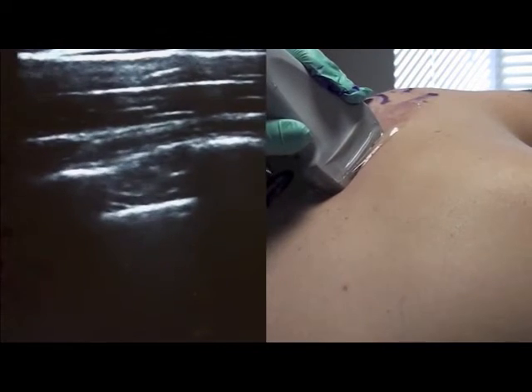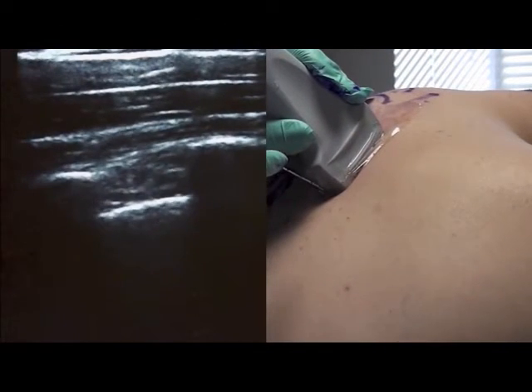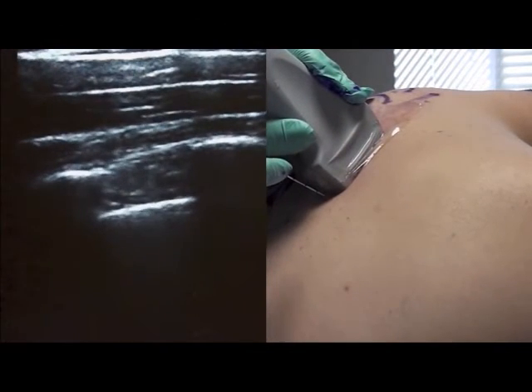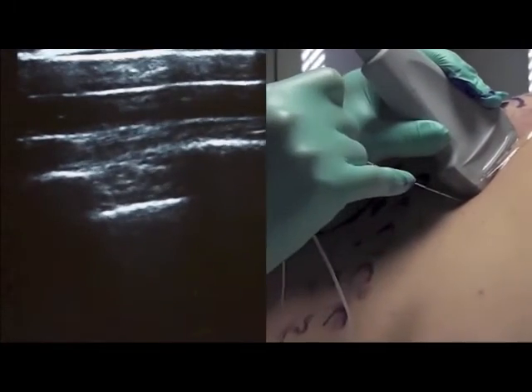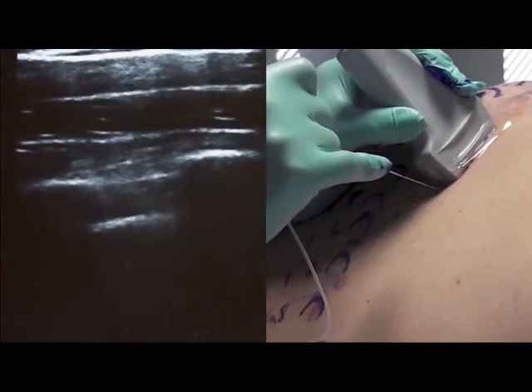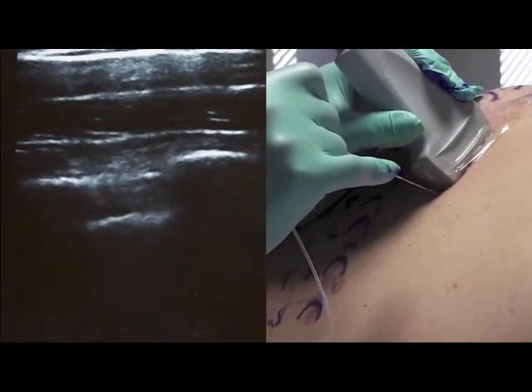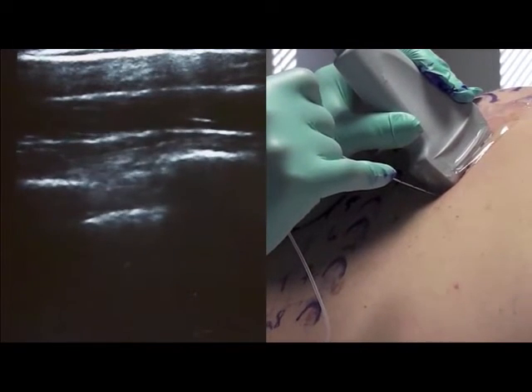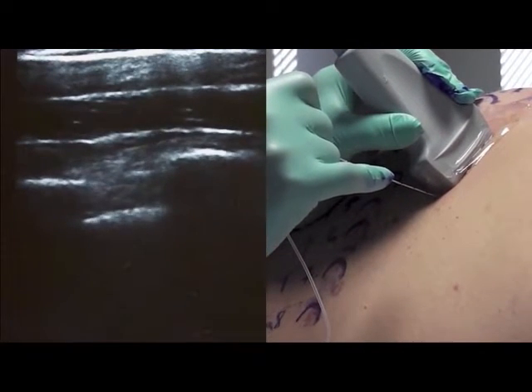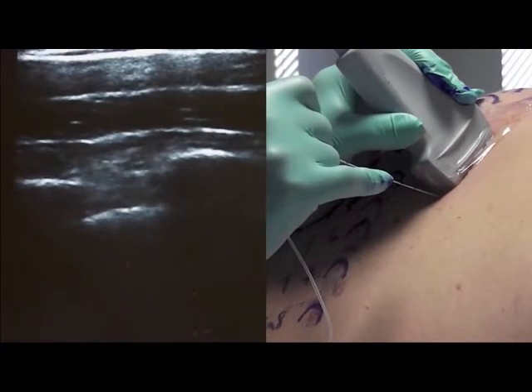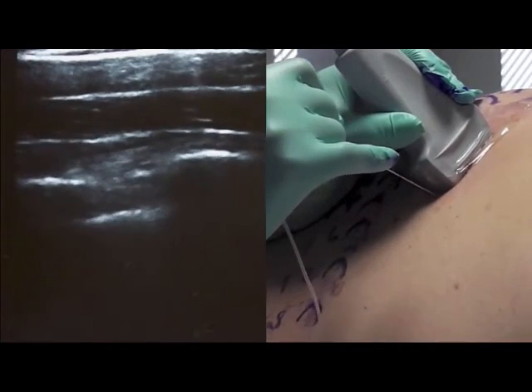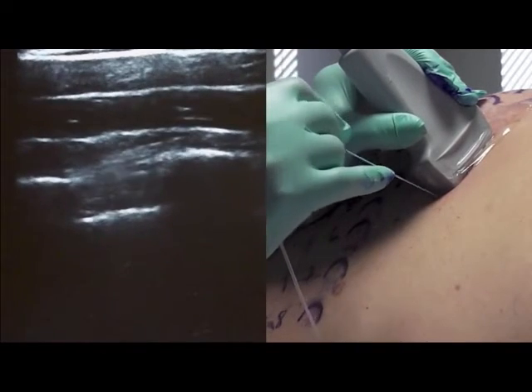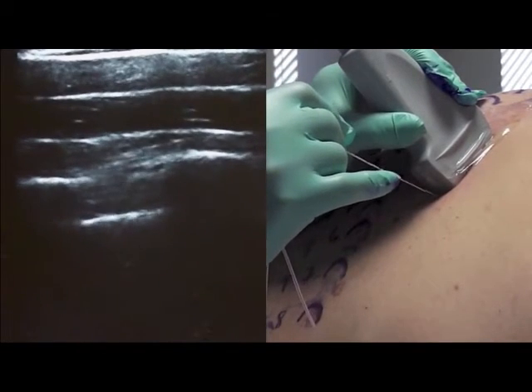This is typically the angle at which we go in. It's the type of block where the needle will come in and out of plane, and it can be very helpful to have a good assistant who can hydrodissect for you, because very often the tip of the needle will go in and out of plane. With a little bit of local anesthetic or normal saline you can locate the tip of your needle through hydrodissection.